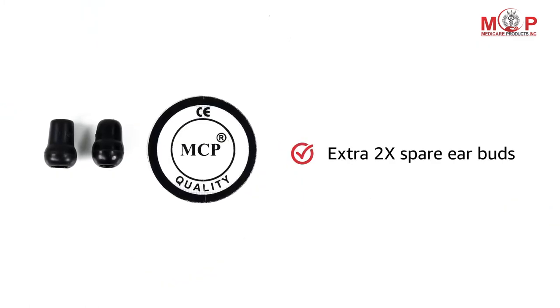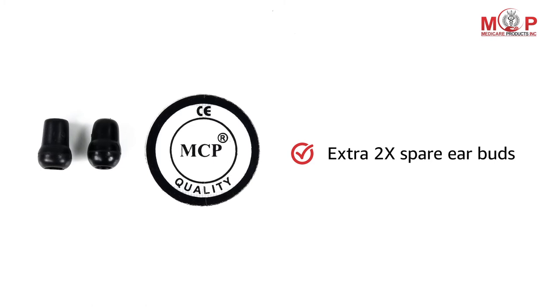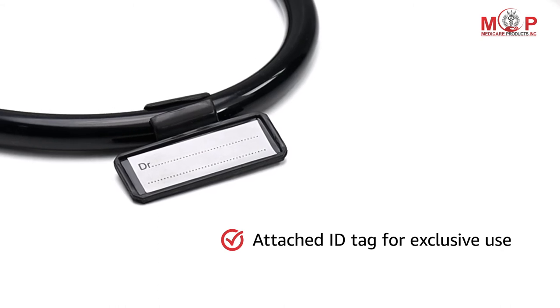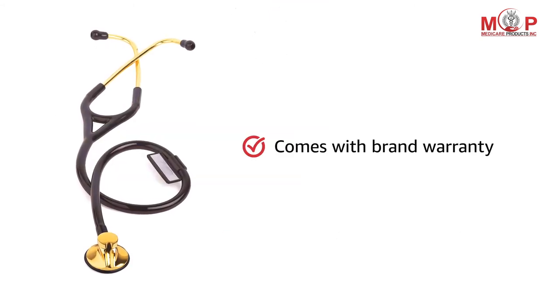The MCP stethoscope comes with two extra spare earbuds. The attached ID tag provides a touch of exclusiveness. This product comes with brand warranty.